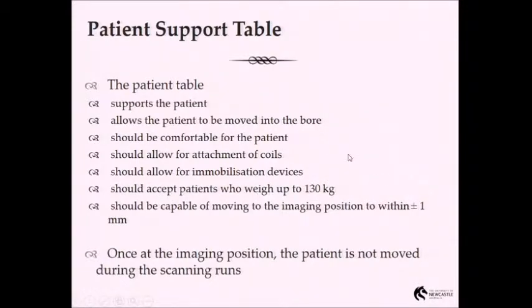There's always been this idea that tables only have a weight limit, and in my experience what normally happens is, I started off using MR when 55 centimetre bore was the standard size. That's 55 centimetres across the bore, and even with 55 centimetres, people like me, and I'm not big by any stretch of the imagination, my shoulders would touch. I scan a lot of footballers now, 120, 130 kgs, and the thing that stops them is you can't get them in the magnet.